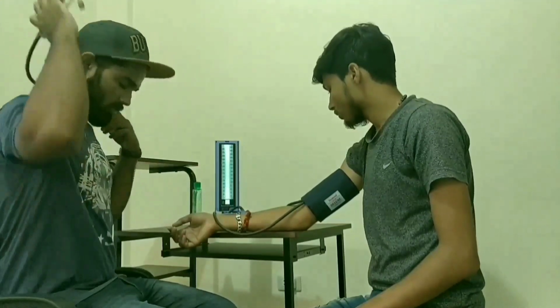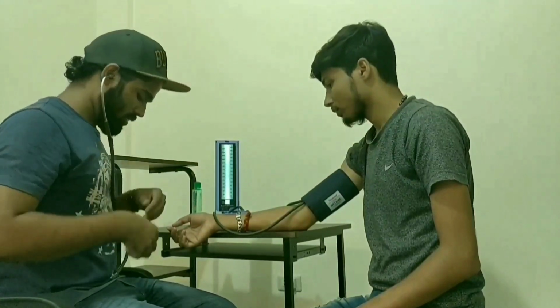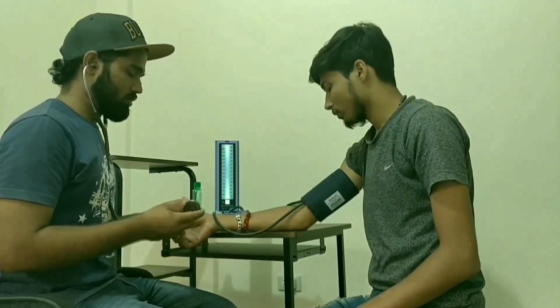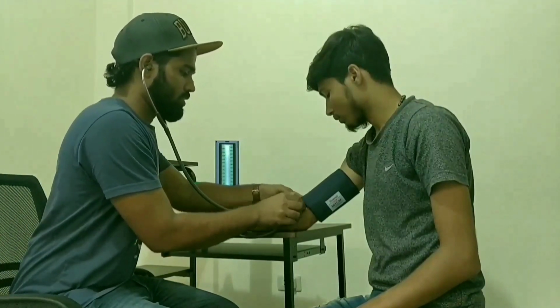And now with the help of the bell of the stethoscope, you will place the bell on the brachial artery, which is on the medial side, medial to the biceps tendon.